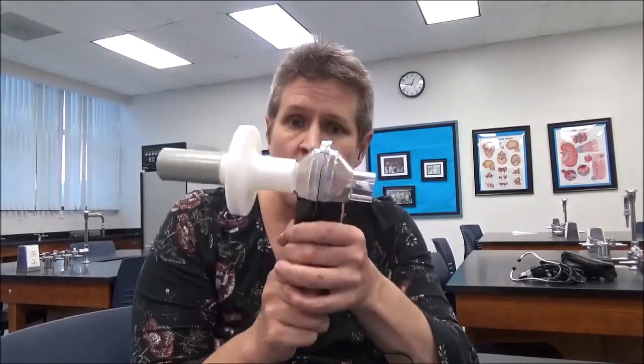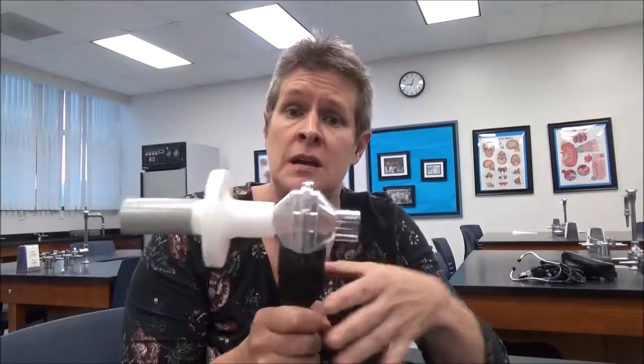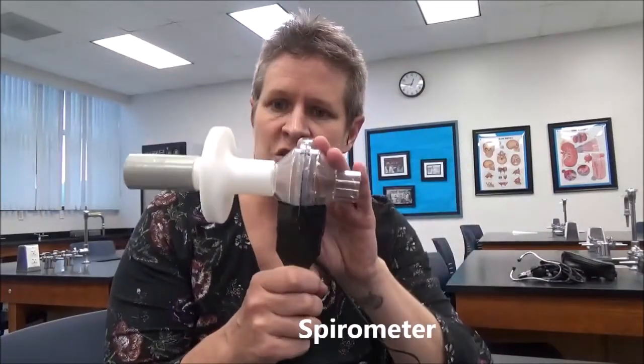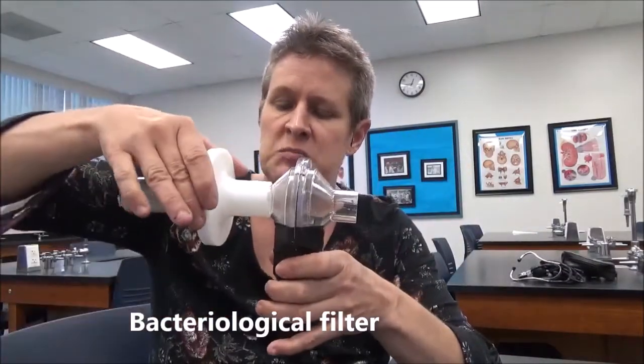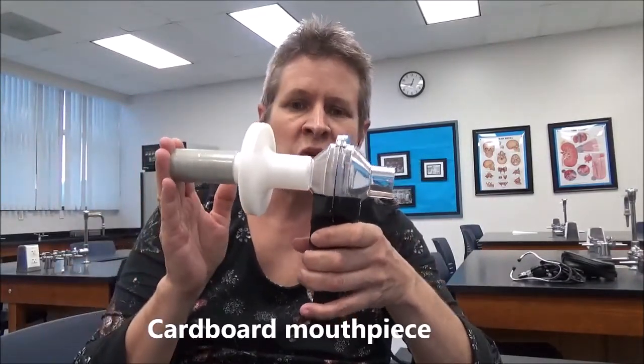Today we're going to do respiratory lab with a spirometer, and we're going to get a normal spirometry reading like you would in any hospital. Okay, we have our Labquest Pro sensor again, and we have a spirometer, this device right here. Connected to it, this plastic piece is a bacteriological filter, and then I've got a disposable cardboard mouthpiece.